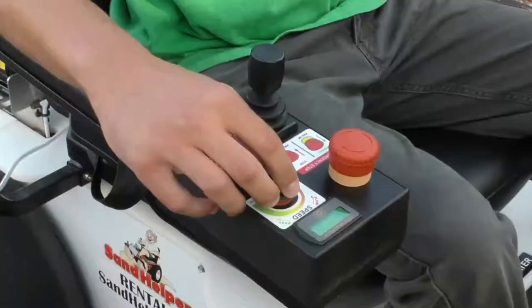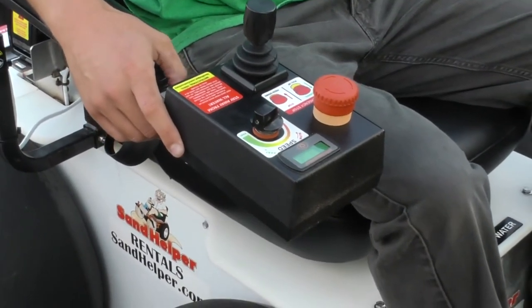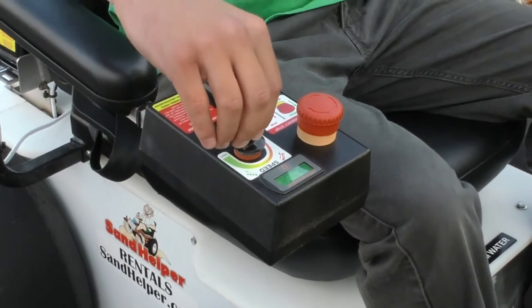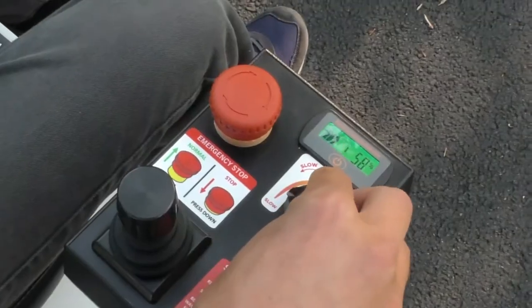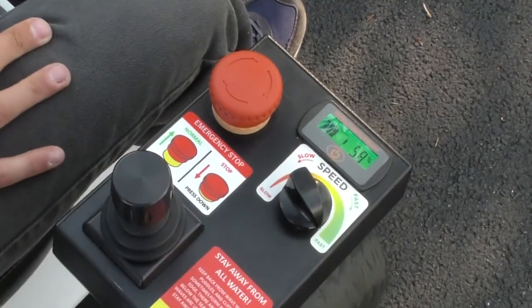On the control panel by the joystick you will find the speed knob. When the knob is pointed to the left side that is the slowest speed, and you can turn the knob clockwise toward the right side for the wheelchair to move faster.